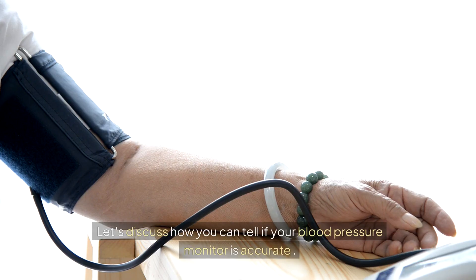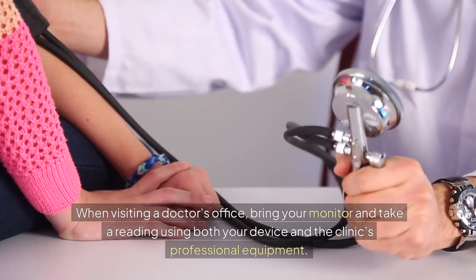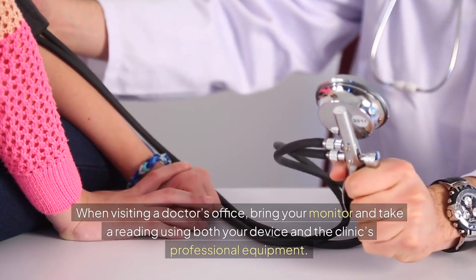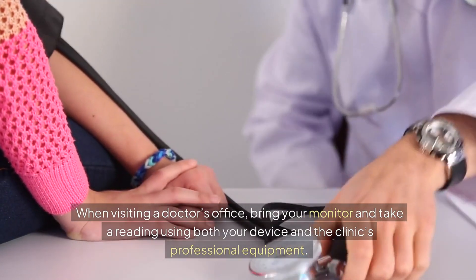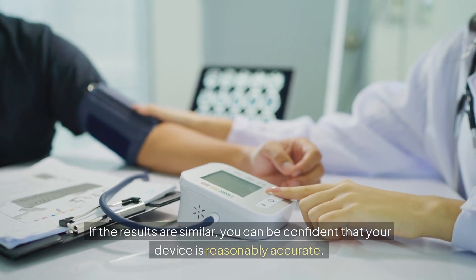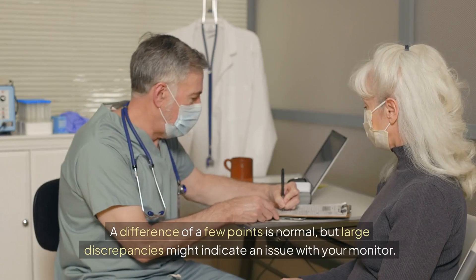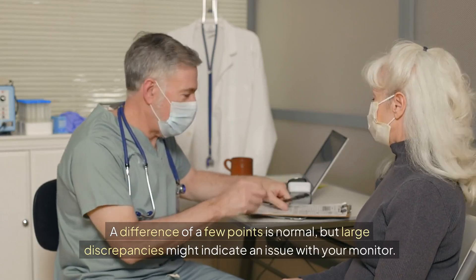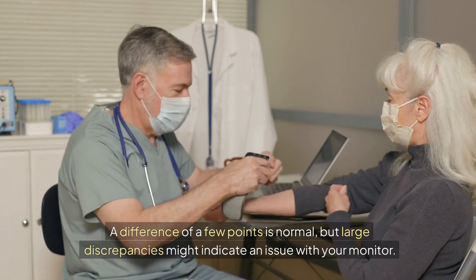Let's discuss how you can tell if your blood pressure monitor is accurate. It's important to regularly compare the results from your home monitor with those taken by a healthcare professional. When visiting a doctor's office, bring your monitor and take a reading using both your device and the clinic's professional equipment. If the results are similar, you can be confident that your device is reasonably accurate. A difference of a few points is normal, but large discrepancies might indicate an issue with your monitor.